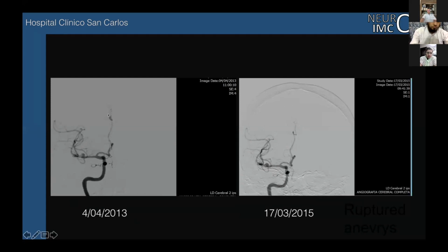In our experience, when the residual neck of the aneurysm doesn't change in the evolution, I decide not to treat it by endovascular treatment because it's stable. This is possible. This point is to discuss from the point of view of neurosurgery.